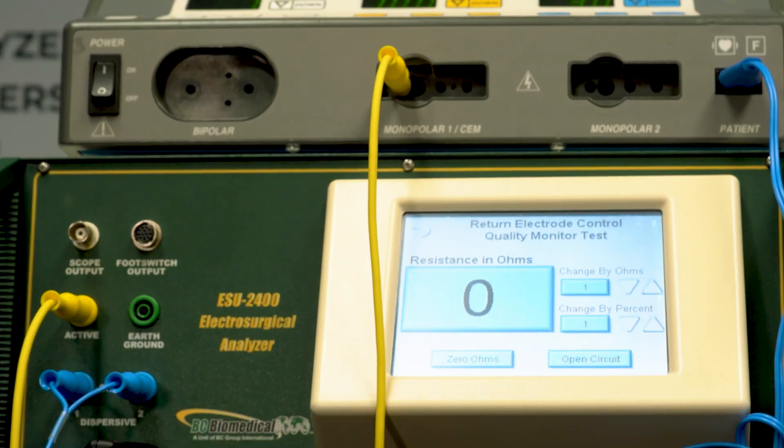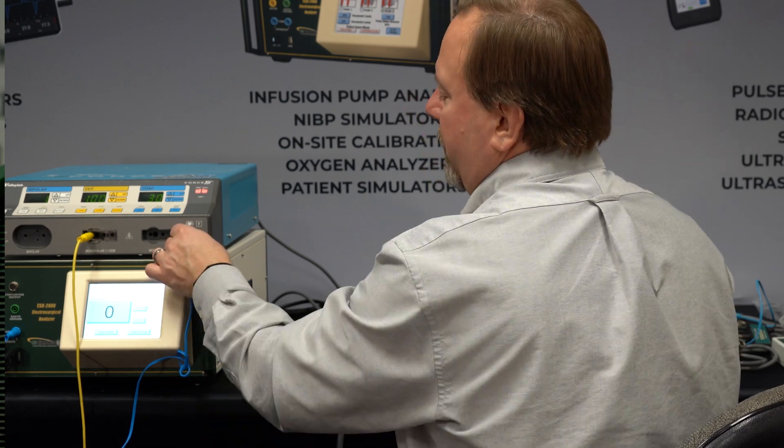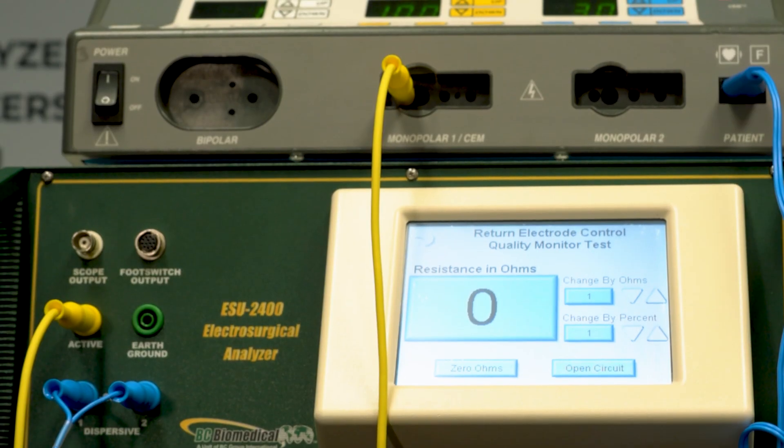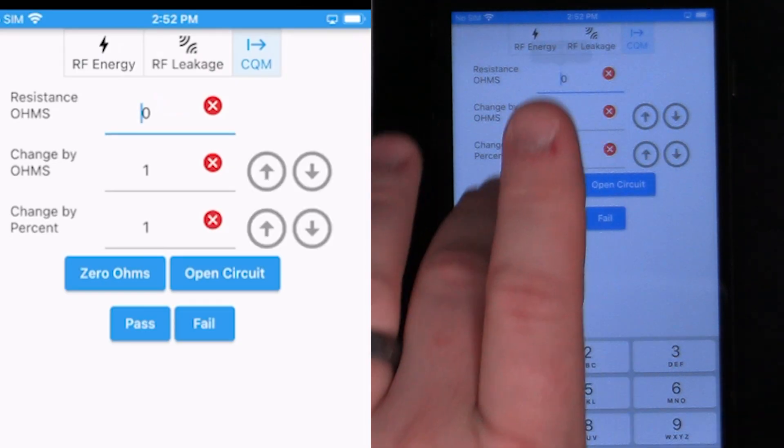Now we can see that the alarm is red, saying that it doesn't like that resistance. For a split pad, it can't have zero ohms. So it knows that that's invalid. We can go in here and set this to, let's say, 100 ohms. And now it still doesn't like that.